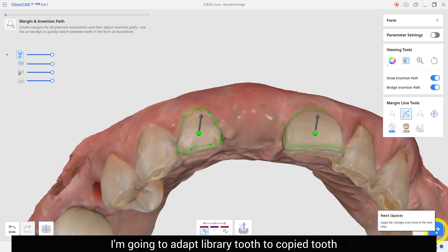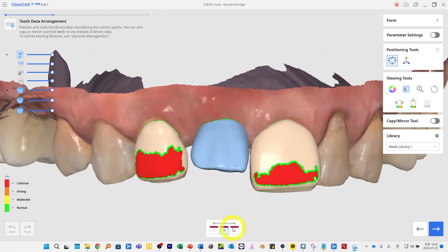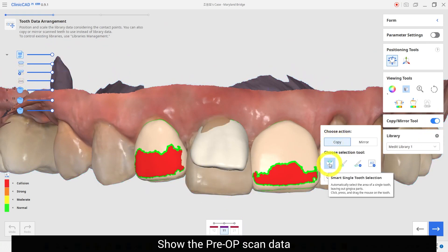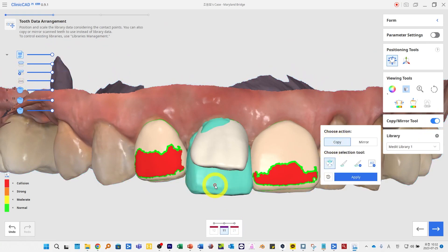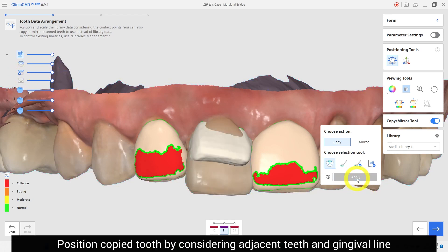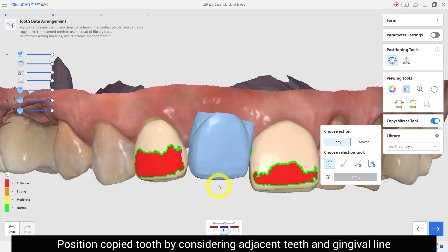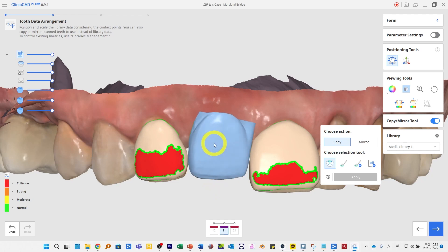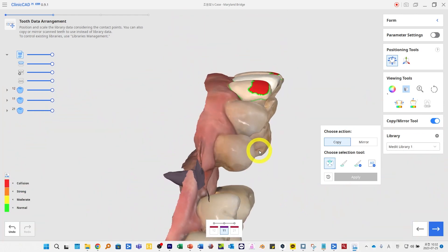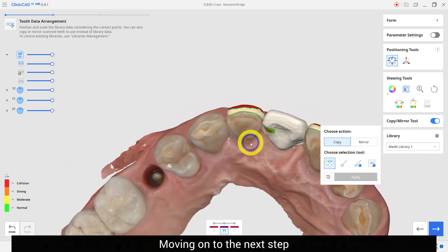I am going to adapt a library tooth to the copied tooth. Click the copy mirror function and show the pre-op scan data. Select the tooth and press the apply button. Position the copied tooth by considering the adjacent teeth and the gingival line.